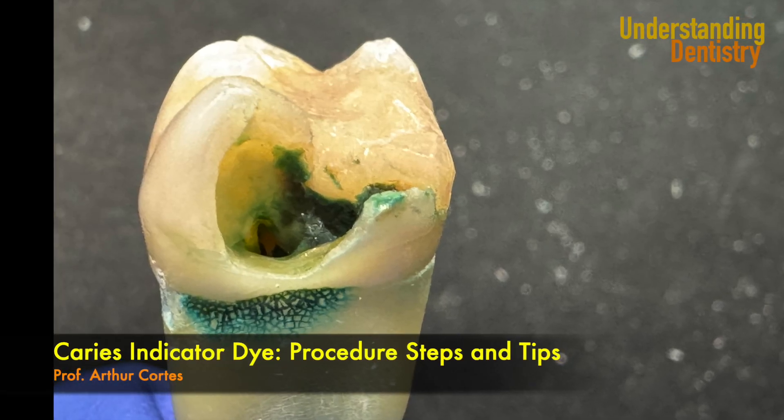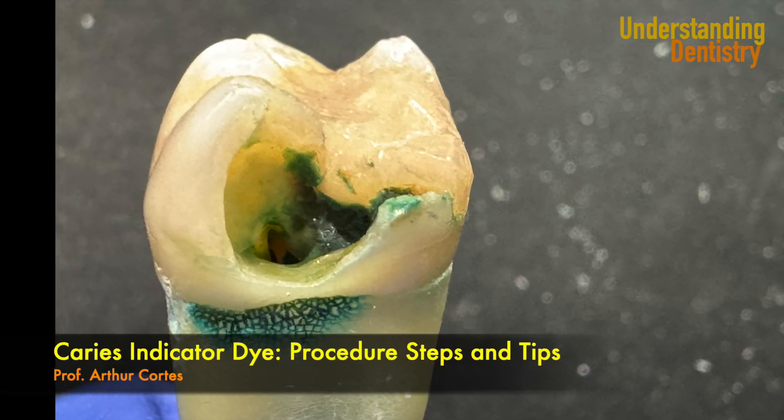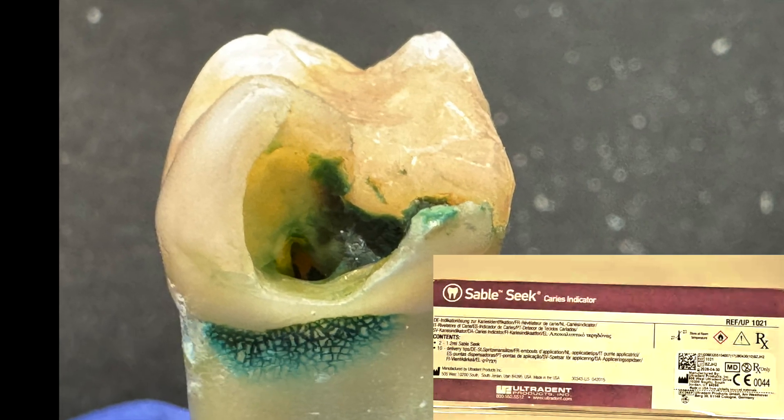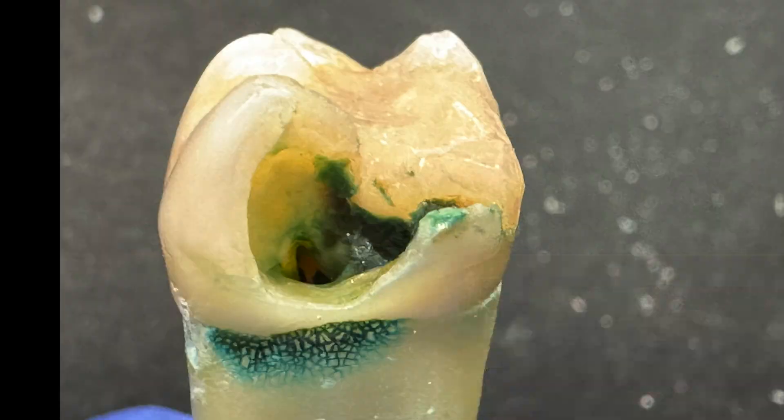Hello guys and welcome to this video to learn how to use the Caries Detector dye or Caries Indicator dye. Here we are using the Sable Seek Caries Indicator from Ultradent.